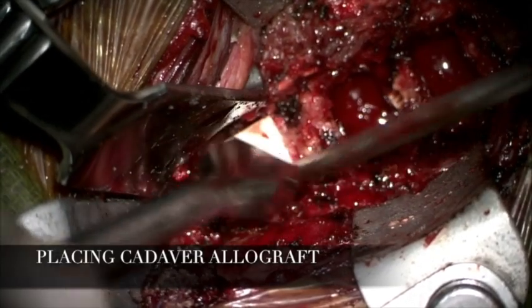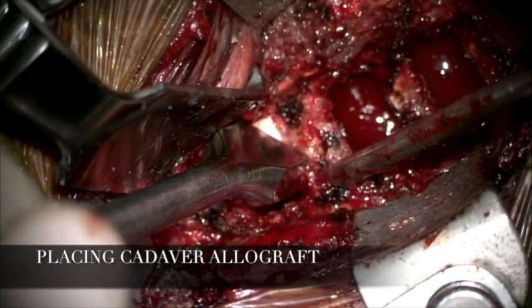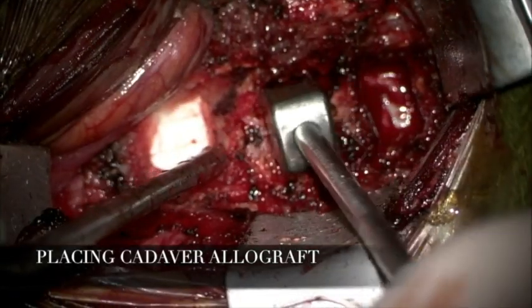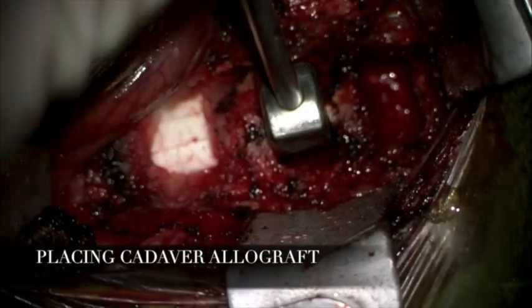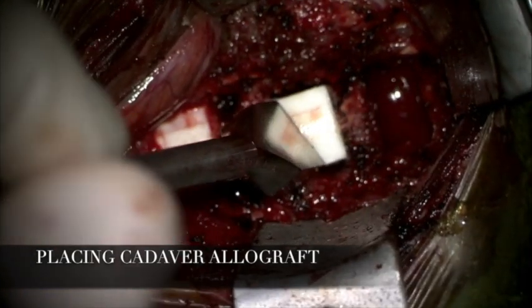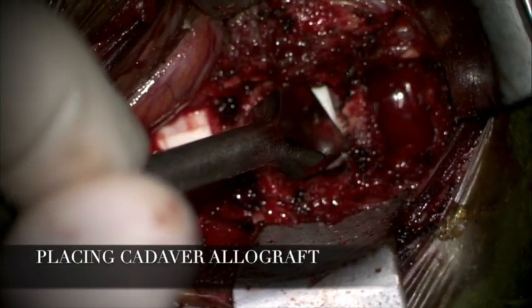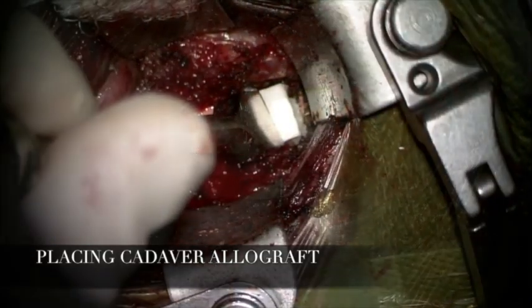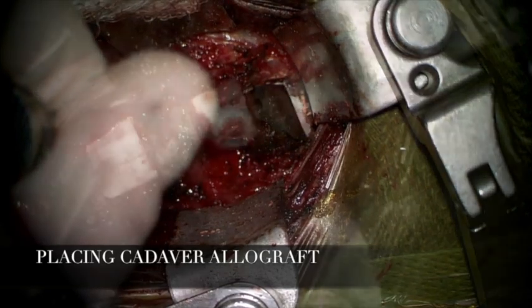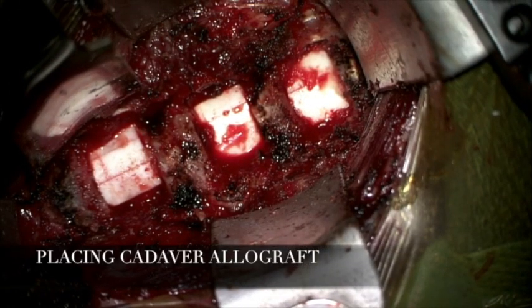We continued using gel foam powder for hemostasis. The same was repeated at the C5-6 level. A trial was used to determine the size of the allograft, and again the allograft was placed in position, achieving intervertebral body fusion at C5-6. Finally, the same was done at the C4-5 level. This is the final view of intervertebral body fusion at C4 to C7.